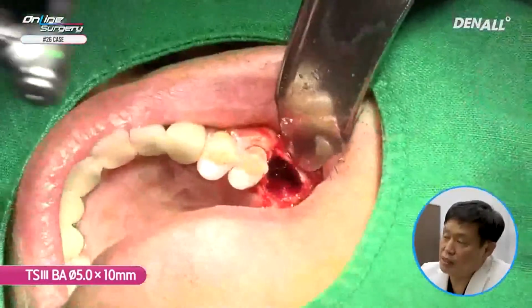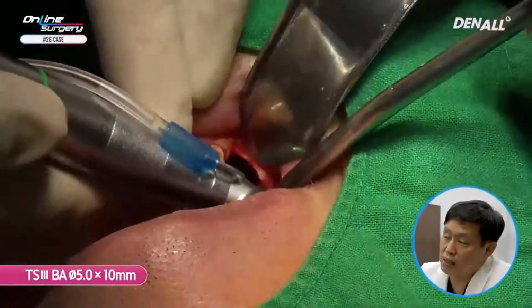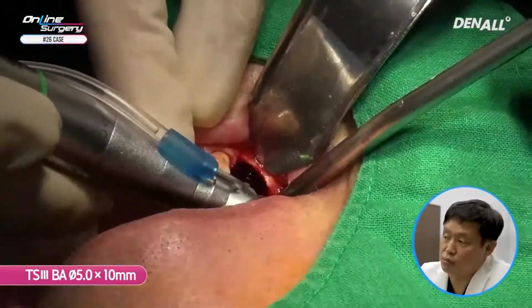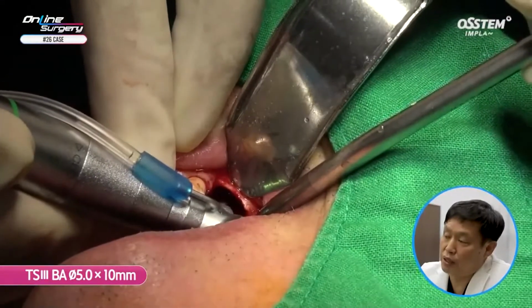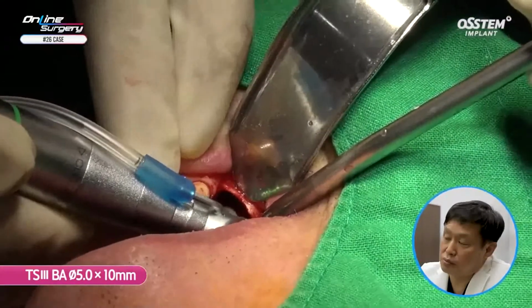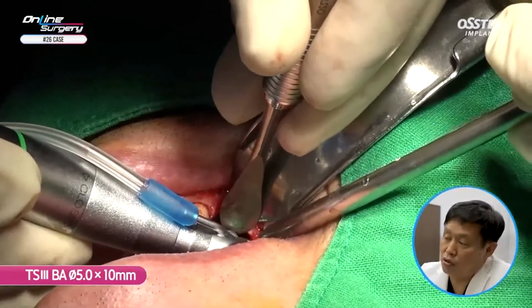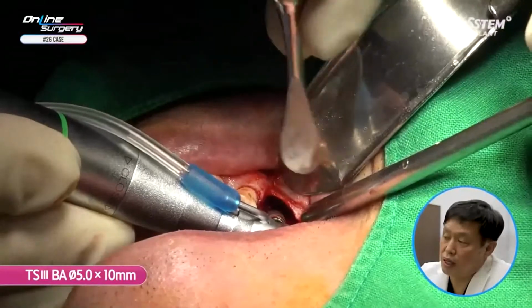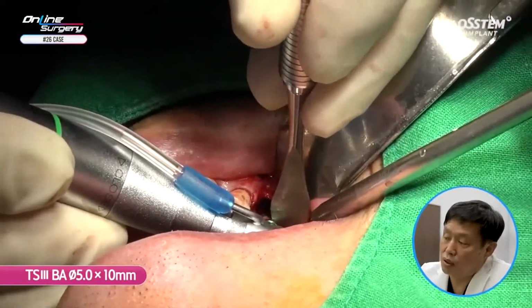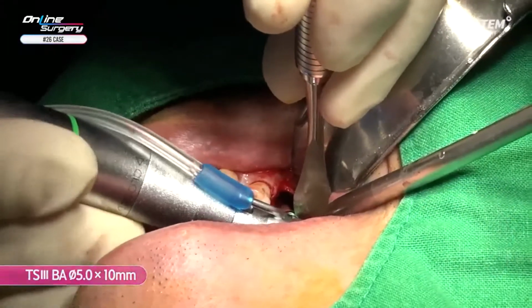I'm going to place the 5.0 by 10 millimeter implant using the engine. There's no buccal bone, so you need to put more strength on the palatal side. It is not easy to get a good hold. If it is difficult, you can use a periosteal elevator in order to avoid implant slipping. The implant has been placed. I believe stability is quite good.